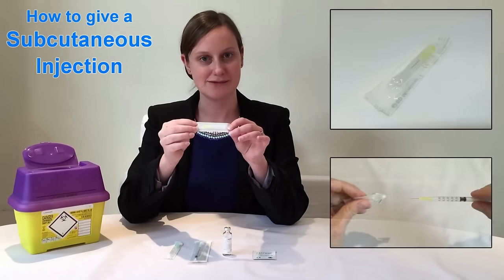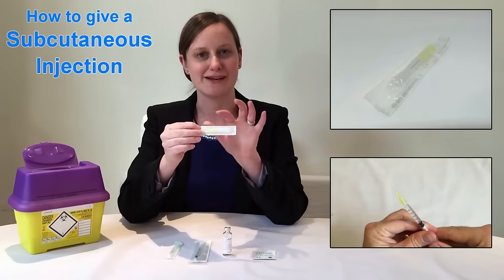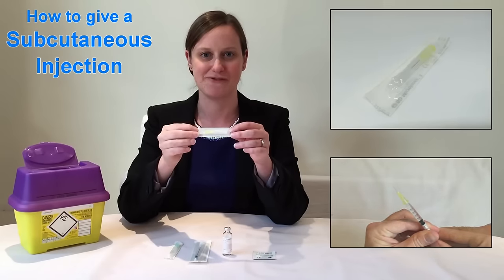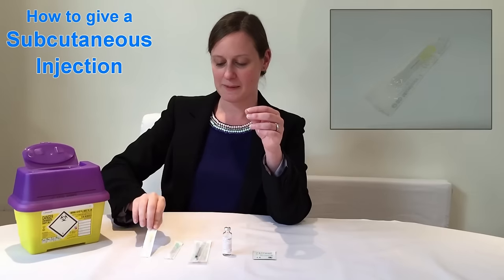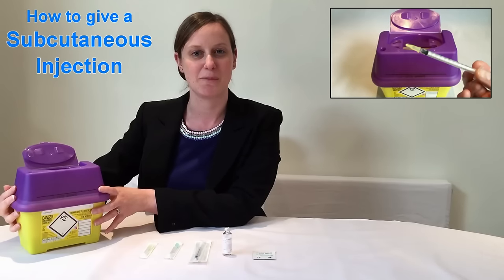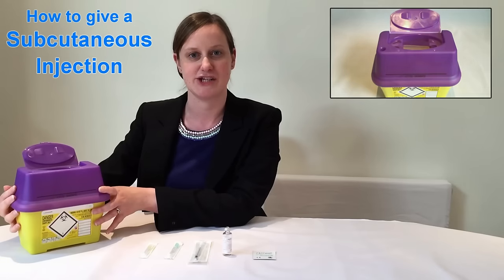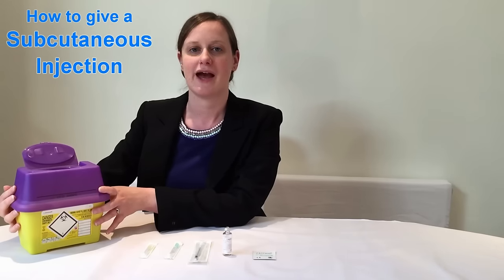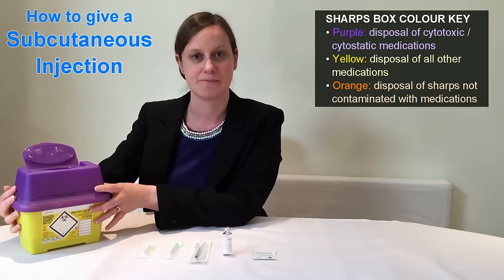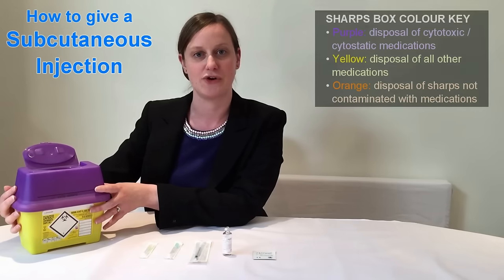This is the yellow needle and this is the needle which we're going to be using for the injection. You can see that it's much shorter, it's much finer, and this makes the injection process much more comfortable. Lastly we've got the sharps box. We use this to dispose of the used needles and syringe and also to get rid of the empty medication bottles. As I'm using a hormonal medication this sharps box has a purple lid, but depending upon the type of medication your sharps box may have a yellow or an orange lid.